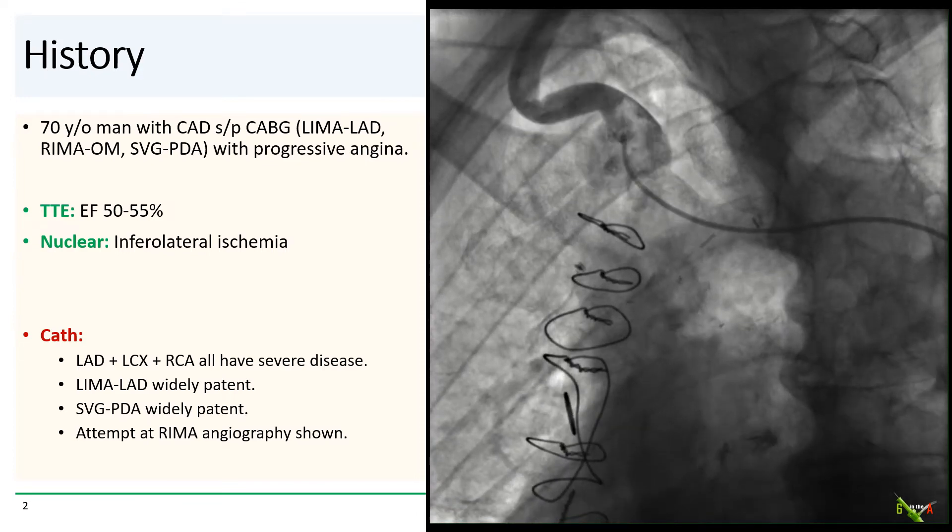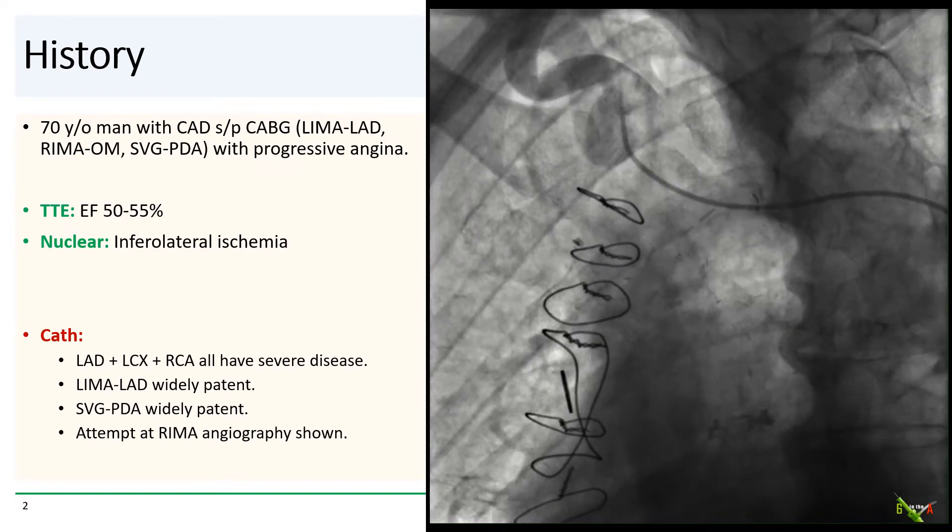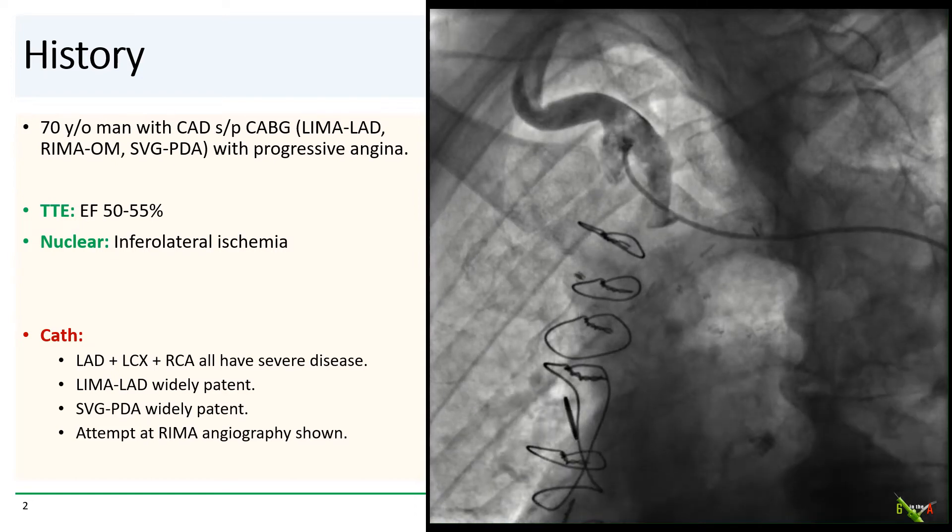On cath, his natives are all severely diseased, but both the LIMA to the LAD and the vein graft to the PDA were widely patent. Our initial attempt at shooting the RIMA is shown here.